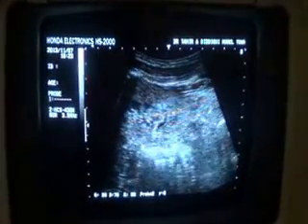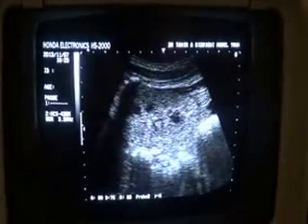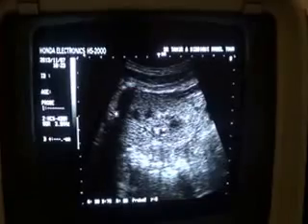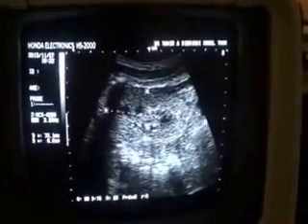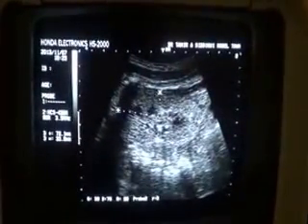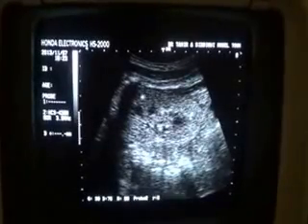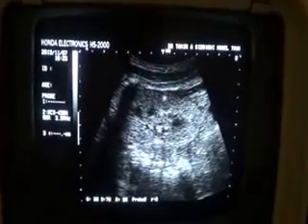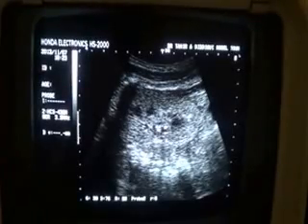In front of your screen is the right kidney in longitudinal section from prone position, measuring 7.3 by 3.3 centimeters. The dimensions are normal. Second, the echogenicity of the parenchyma is diffusely raised. There is no differentiation between the cortex and the medulla. There is no medulla.